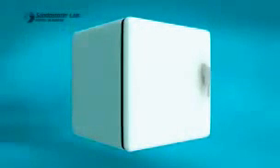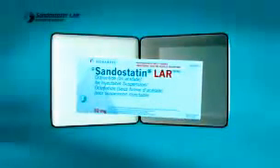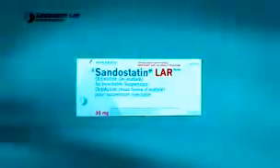Each Sandostatin LAR kit includes everything you will need to prepare the suspension and administer the injection to your patient except for alcohol swabs.